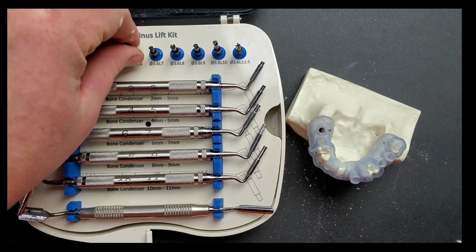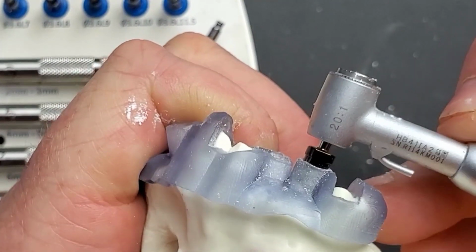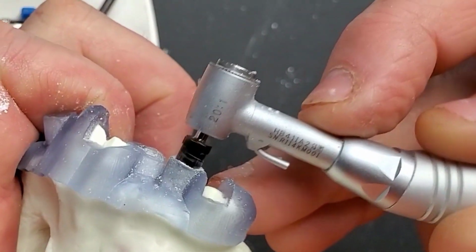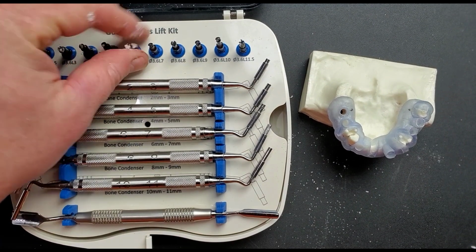Go to your next drill, 6 millimeter length. All right, it's bottoming out without the drill stop touching, so we've still got bone ahead of us. All right. And now we're up to the 7mm drill.